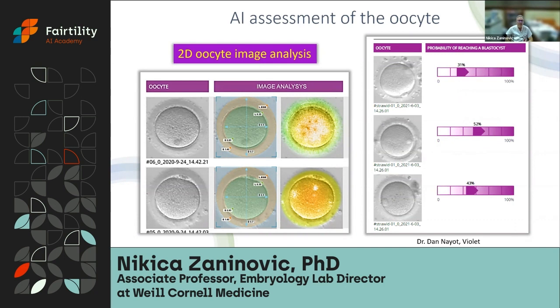All right, and now this is coming to the clinical applications, and it can really tell us which oocytes to use primarily. Of course, we would like to see that in the future, we will not only see that it reaches the blastocyst, but we would like to see how this can predict reaching a high quality blastocyst, even chromosomally normal embryos.